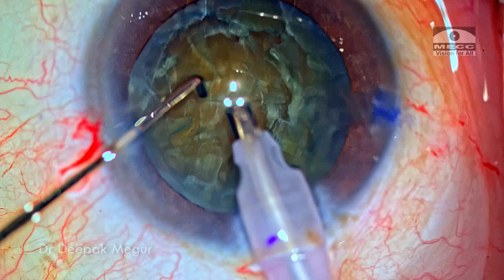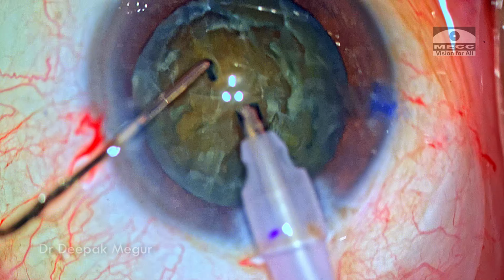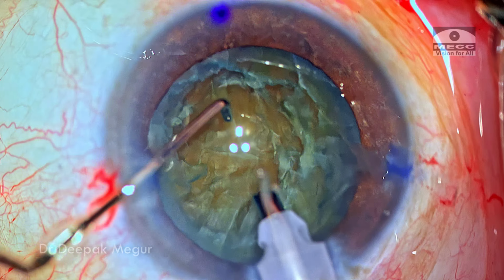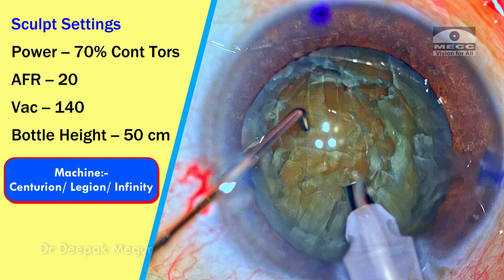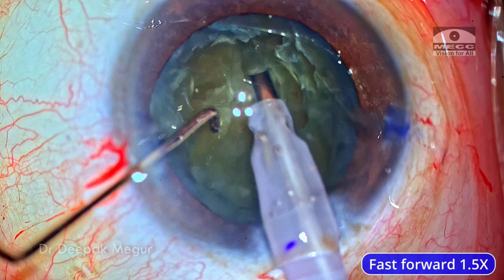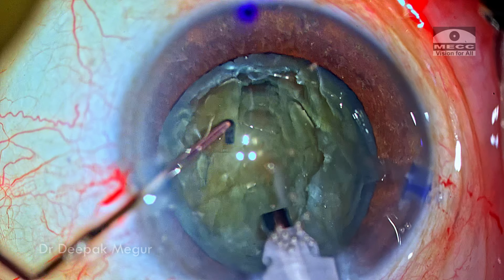Now in this case, I'm anticipating a slightly softer nucleus, and I was expecting that it could be slightly difficult to crack. My plan is to do something like a stop and chop technique in this patient, and let's see how things turn out. So these are the sculpt settings, and as the sculpting is being done, be careful that it is a long, thin track which is being created.